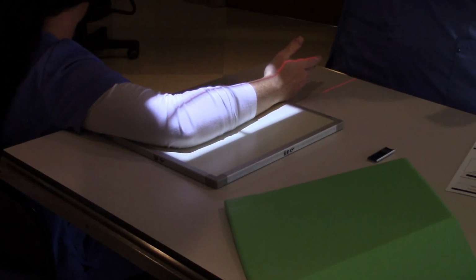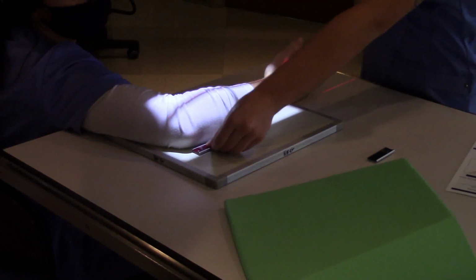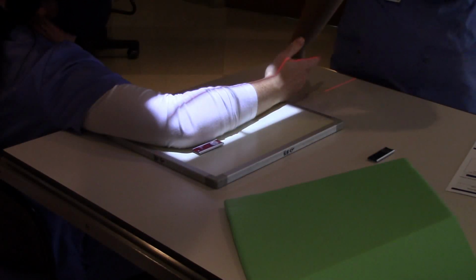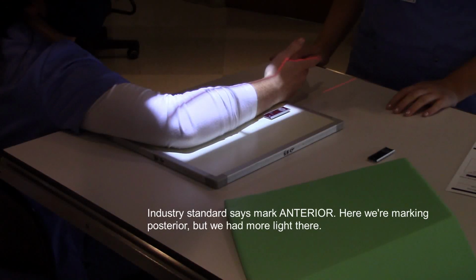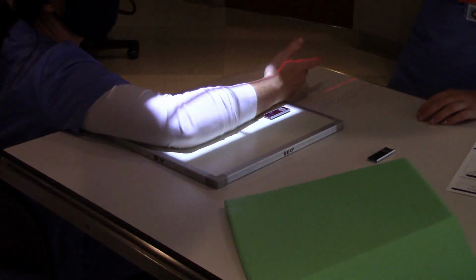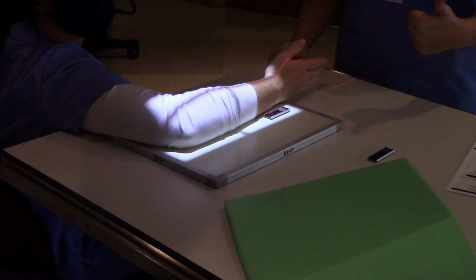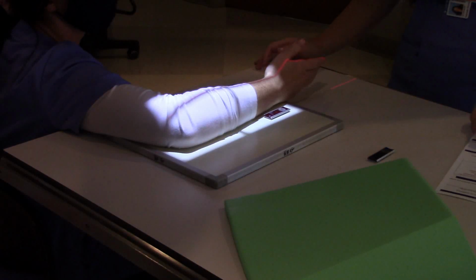But lengthwise, I would leave it open like you got it, because I can see that her elbow shadow is getting close to the edge of the receptor. Is that where you put it? I would put it, okay, look and see where's the widest area of light that you've got. Yeah, there you go. Just make sure your marker's not in the anatomy, but you want it in the light field, but not overlapping her skin, if you can avoid it. That looks good. I guess that's all for forearm.